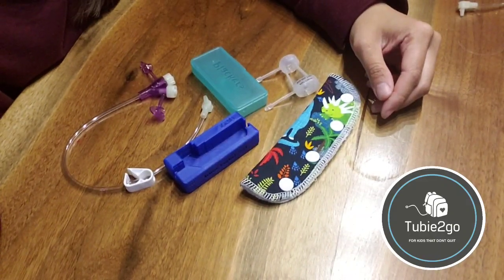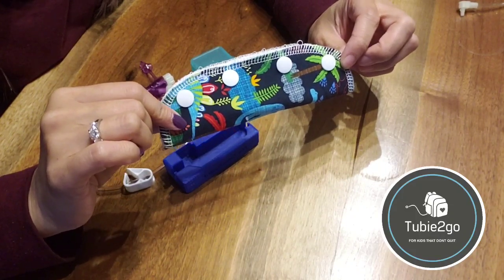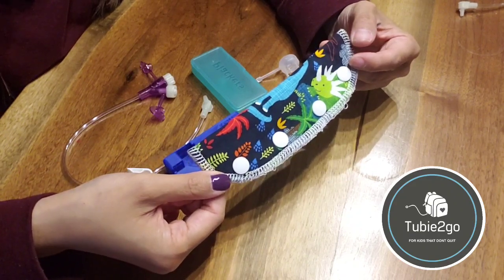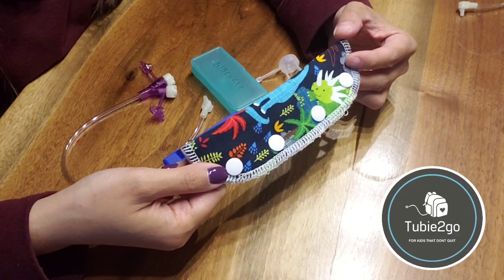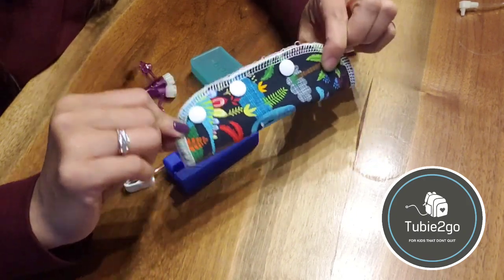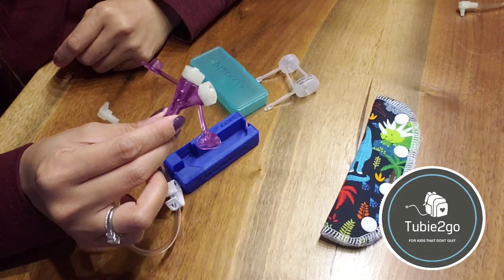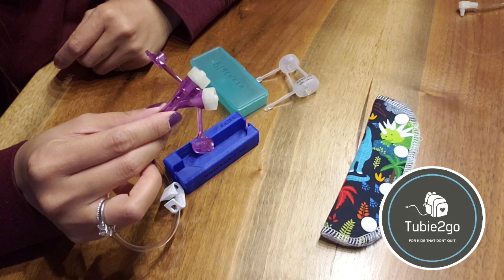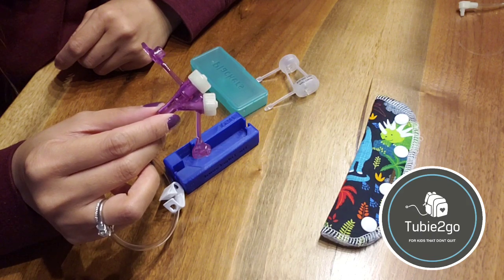So to summarize the solutions that I've reviewed in this video, there is a port cover option, which is probably one of the cheapest and most universal solutions, but is not going to help disconnecting ports if it's as a result of force behind the ports disconnecting, if there's tugging motion, or if it's just curious hands that have the fine motor skills to undo this solution. There are ENFit connections, which will require a whole change in supplies from your medical supplier, and as well you might have to consider a change in the type of syringes that you use to administer medications.